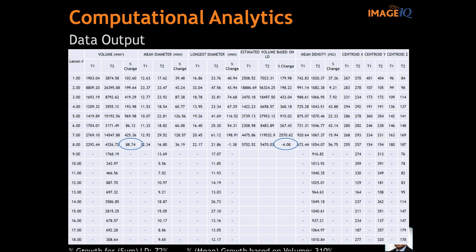Right, and it speaks to why you would want to do this up front in a clinical trial too. Let's say you had your drug approved based on RECIST criteria, and then you were trying to sell your particular drug on the market, and some clinicians said, I want you to tell me how much change in the volumes you have, not just the longest diameter, because that doesn't make any sense to me. Well, now you're going to have to go back and redo all of the images that you already did and have radiologists actually draw outlines around all of the volumes. If you had done this up front with automated software, you wouldn't have to worry about any of that. So you have the data because you ran through it once, right?